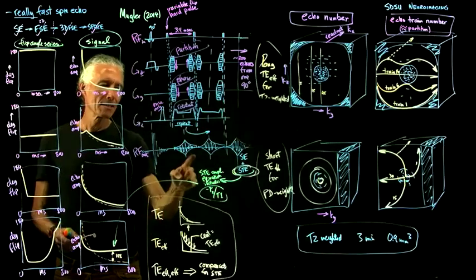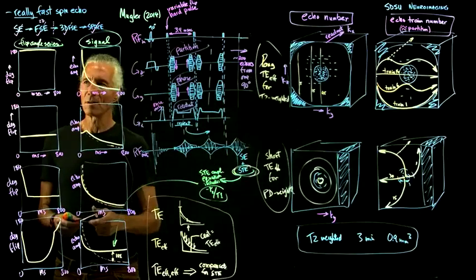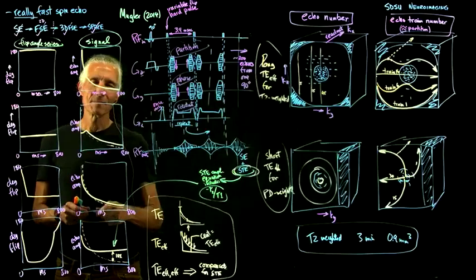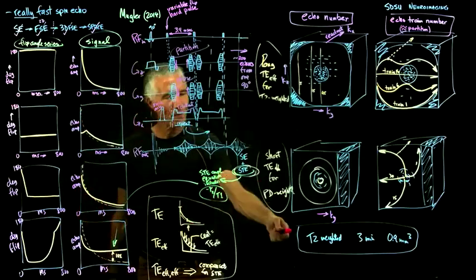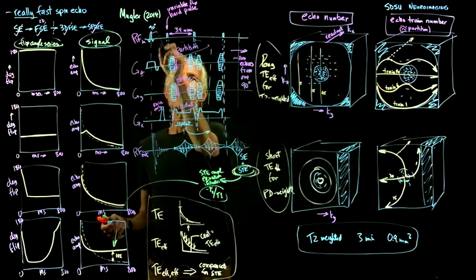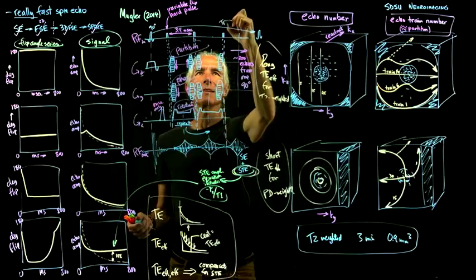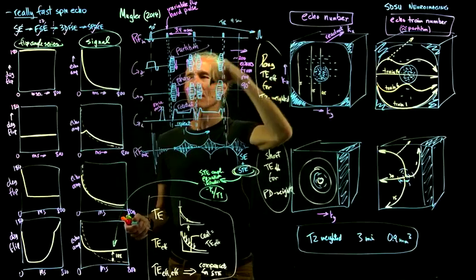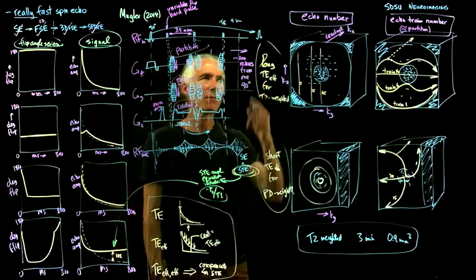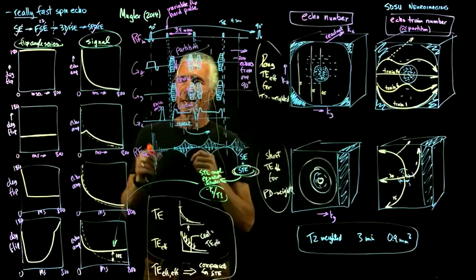But the contrast is not going to be the standard spin echo contrast. It'll be a little bit different because of all the stimulated echoes. The equation is more complicated, and it's got this T1 factor in it. But we're going so fast, we can wait quite a long time. So we can still wait like 4 seconds or something until we do another 90. We can still have a TR of like 4 seconds, because we're using up so much extra time collecting the data in between that we can afford a long recovery time, so we don't get any T1 weighting.